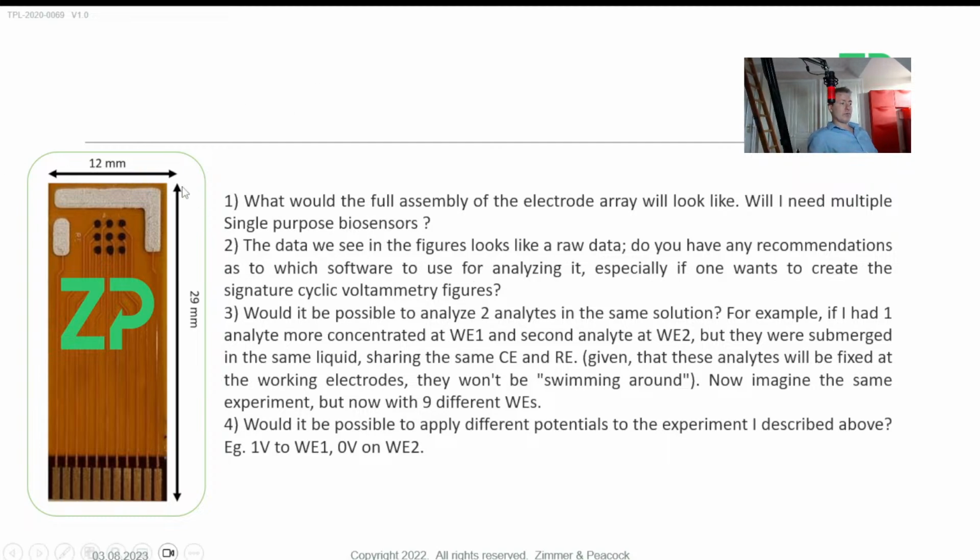If you're not sure, that really is a workshop question, because it's hard enough to describe how to do one analyte at a time, but here I'm trying to describe how to do 9 analytes at a time. Typically we would make biosensors doing 6 analytes at a time. We do have quite a lot of technology around that, but in theory you can do sodium, potassium, chloride, glucose, etc. on something like this.